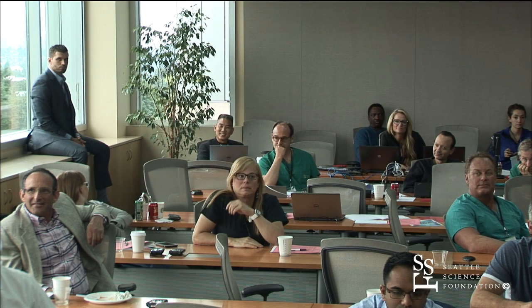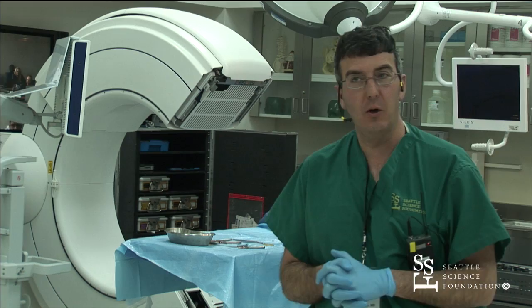I'm ready. Are you ready? Yeah, let's do it. And by the way, I don't use a lot of O-arm. I heard that comment. I actually do use the O-arm. We bought an O-arm many years ago and we used it as a coat rack. And so I started to use it — actually what happened was we've gotten a lot of adult scoliosis patients.